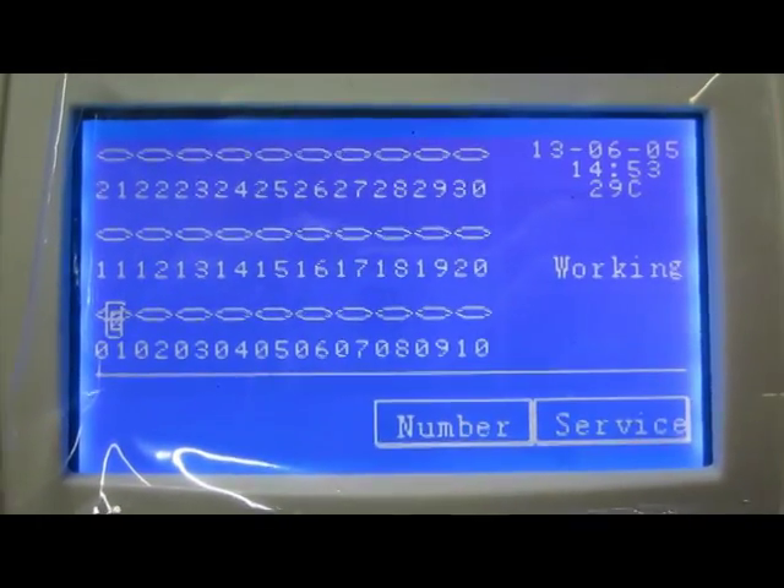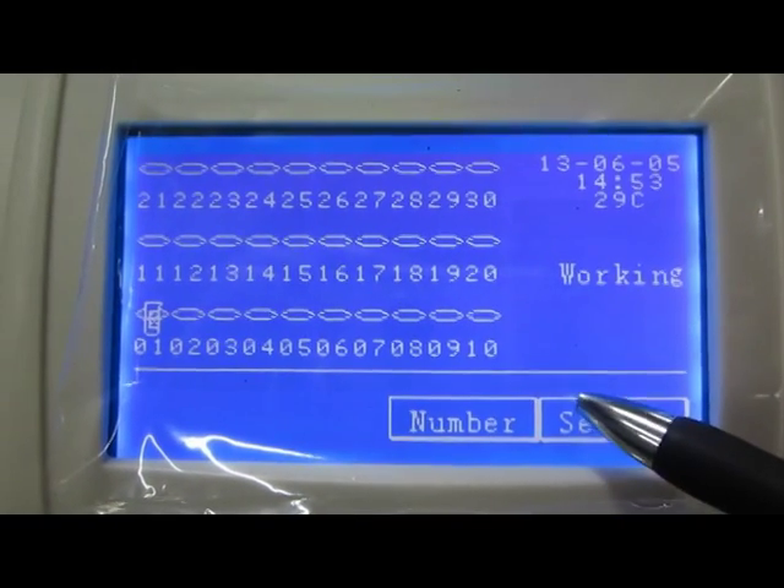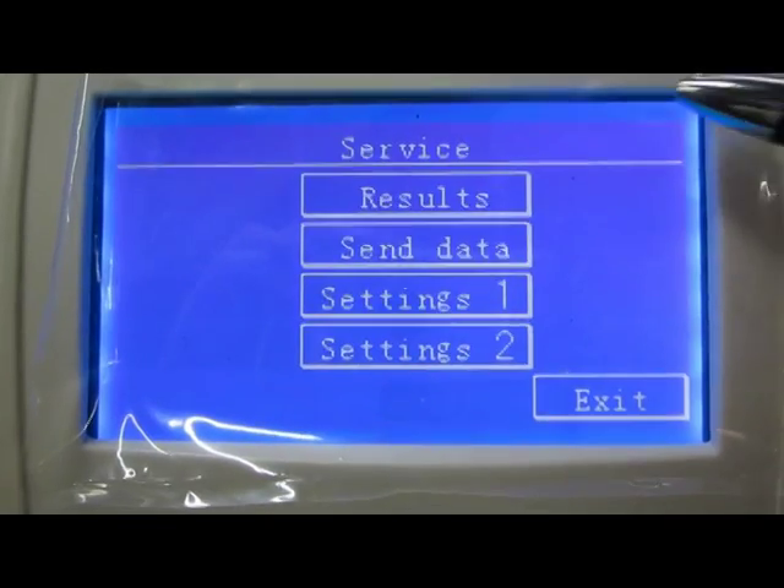Now let me explain the sub-menu in detail. Click Service. We can see four options.